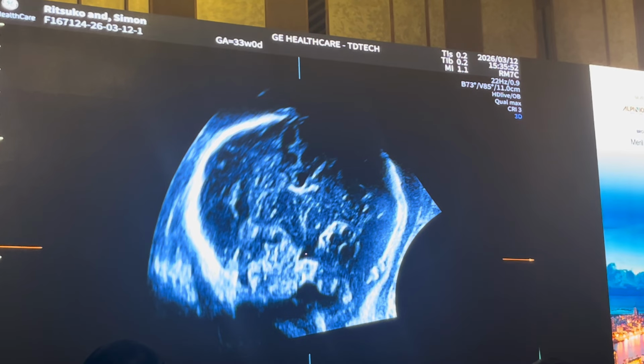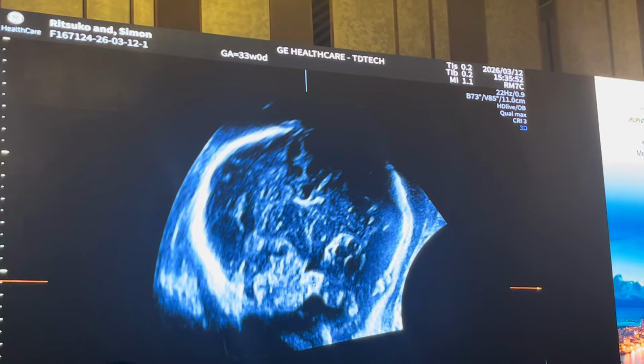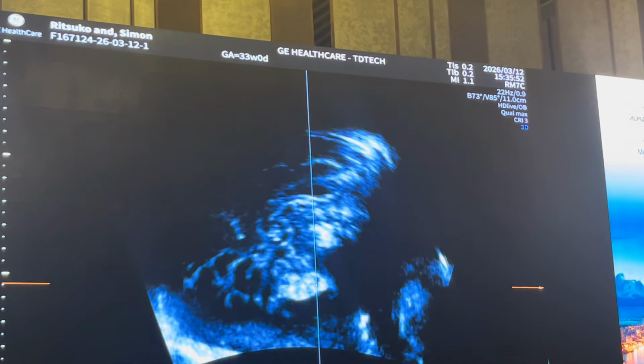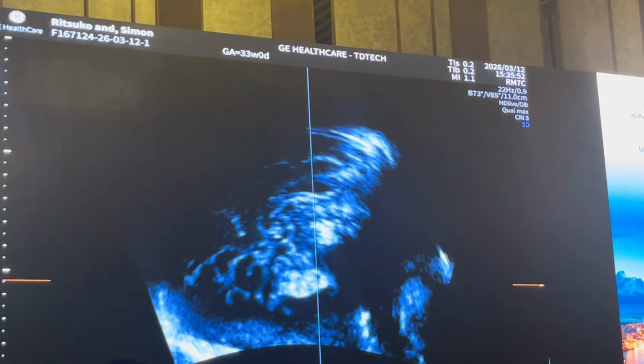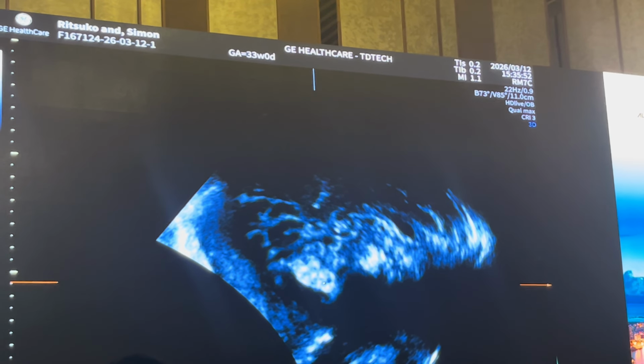You can, if you want, place a reference dot in the fourth ventricle if you've got, say, Blake's pouch and you want to see if it's anti-clockwise rotation. I prefer to put it in the vermis, and then I rotate 90 degrees to see whether I've got a view of the vermis. Once I do that, then I rotate around the Z-axis, and then I hit my VCI.